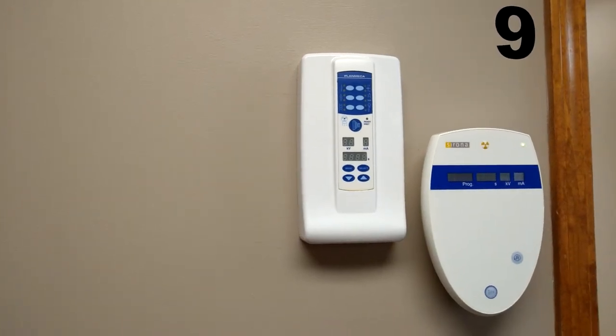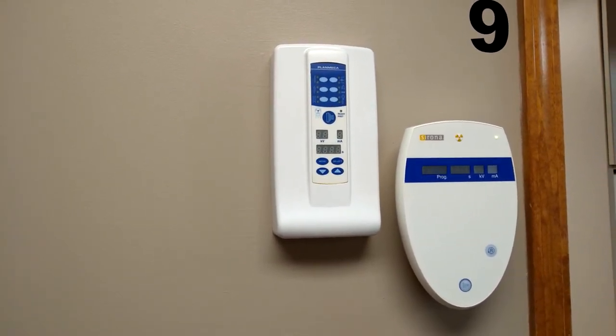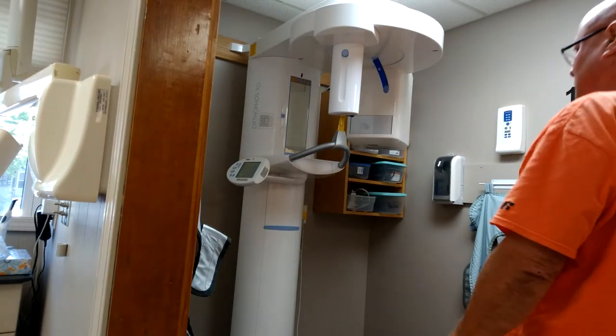Okay, so here's the buttons and the controls. Which one is the one for the start? All right, this one controls the start. All right, okay, it's going. All right, I gotta put a lead vest on you.